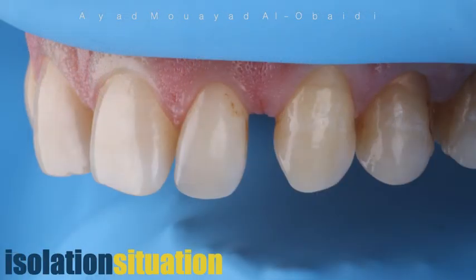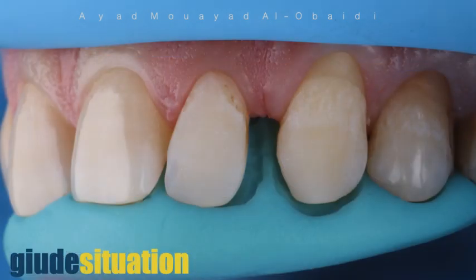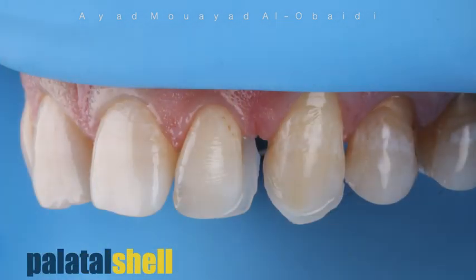When we have super healthy gingiva, we can use the split dam isolation technique. The silicon key is placed again, and the palatal shells are constructed. This step is very delicate, so careful modeling is very necessary in order to not glue both restorations. The shells can either be done one at a time or together, as in this case.